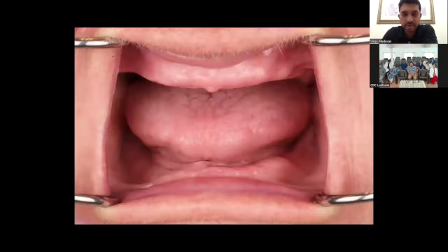So this is again an intraoral view. You always want to take a look at the tongue position. The patient has a retruded tongue, as you can see, that makes your denture fabrication, especially the mandibular denture, a little bit more unstable. So these are some of the things that you discuss with the patient and then tell the patient, okay, we can obviously make you a new maxillary and mandibular denture, but because of these consequences where the floor of the mouth is not favorable, the tongue position is retruded, that can cause instability of your denture. So a fixed prosthesis can be done in the mandible.